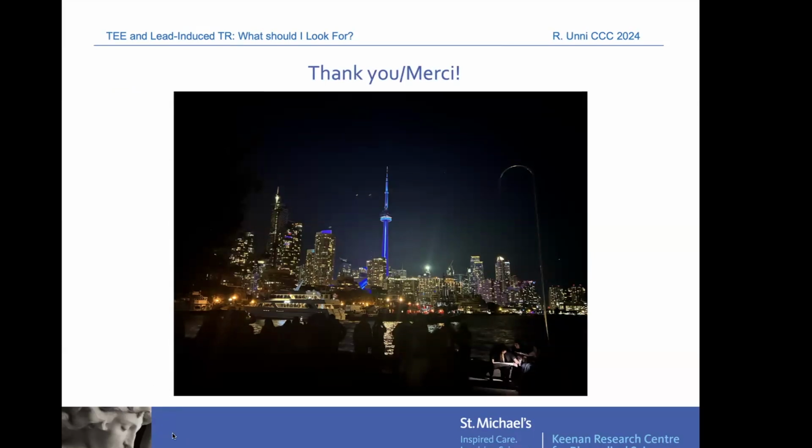So thank you, Dr. Unni, for presenting this, and it's really fantastic, and it highlights an aspect of where we are in our history of development of echocardiography, where now AI is taking a place in what we do every day. But this particular situation highlights the importance of using human intelligence, of actually understanding the anatomy, being tenacious about looking at where things are and how the lead interacts with leaflets and the leaflet anatomy. So there's a lot going on in terms of understanding it.